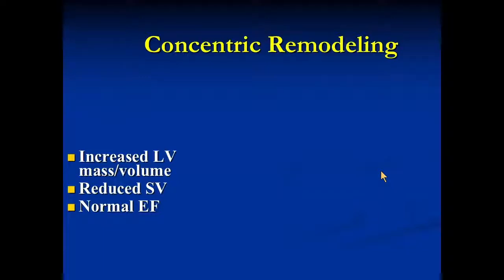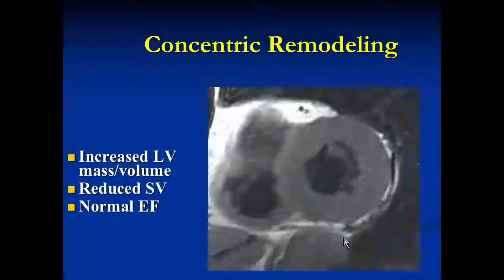In most of these patients, the issue is going to be concentric remodeling. So in most of the patients who don't look dilated or hypertrophied, the final diagnosis is going to be an elderly person, somebody with a small heart that has what we call heart failure with preserved ejection fraction, or HFpEF. This person keeps coming back to the hospital with a ventricle that looks like that, hypertrophied, but the LV mass is, in absolute terms, really not increased.